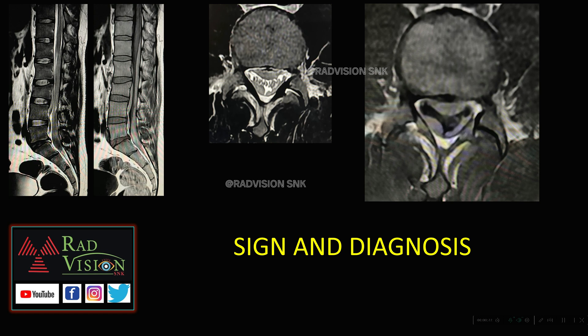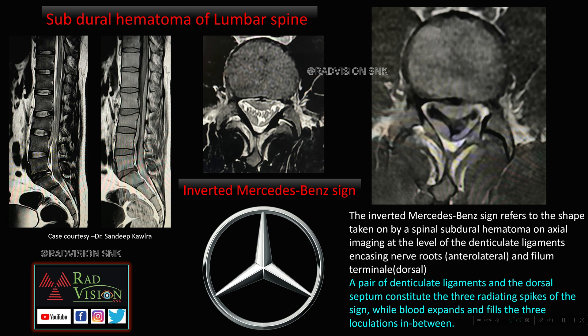The first sign — you can pause the slide and guess the sign and diagnosis. This is called the inverted Mercedes-Benz sign, seen in subdural hematoma of the lumbar spine. On T2 sagittal and T1 weighted images, you can see the two denticulate ligaments and the dorsal septum, which resemble the spikes of the Mercedes-Benz logo but in an inverted fashion.